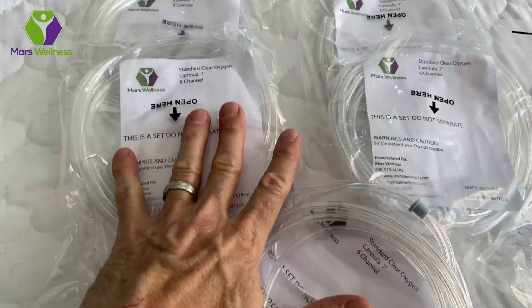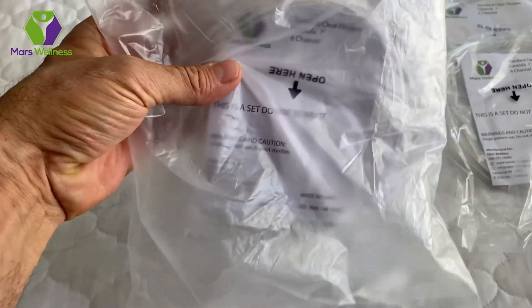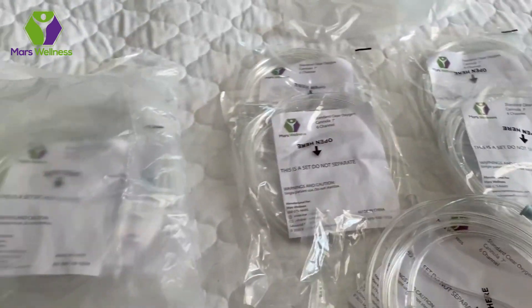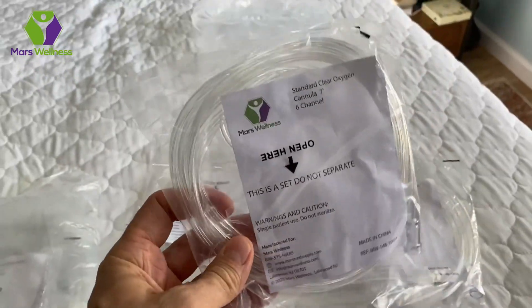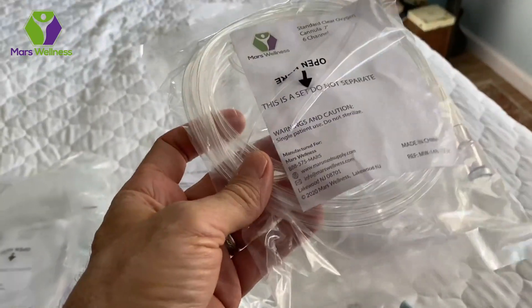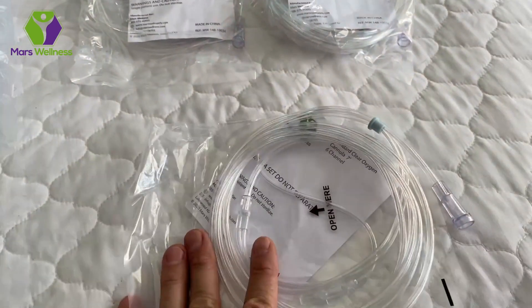This is a 5-pack — it came in a bag like this. If you got a 10-pack, you get another bag, also a 5-pack, so all together it's a 10-pack. You can get either the 10-pack or the 5-pack. Each one is individually wrapped. The oxygen tubing is wrapped for one-time use, so you don't have to worry about cleaning it. You use it once and then you toss it when you're done.